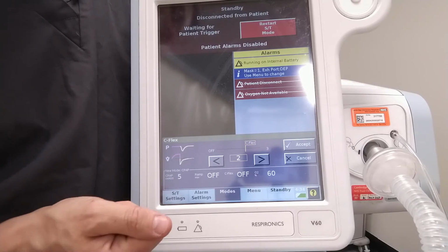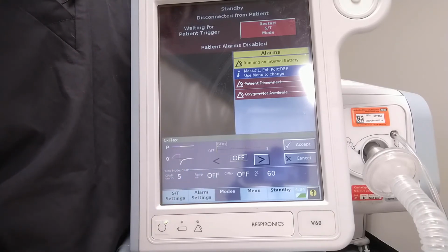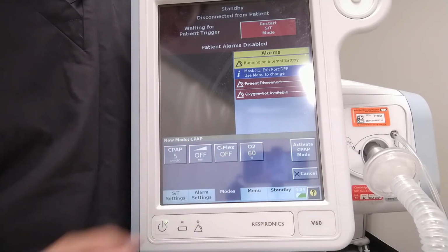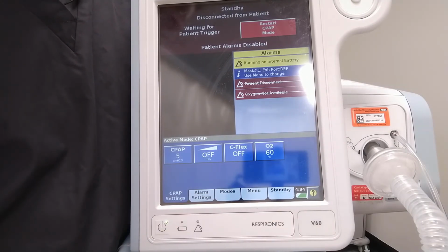What I'd recommend is, when you're starting off CPAP in the patient with acute respiratory failure, leave C-Flex off and accept it. And then go back into the settings later if you find the patient is finding it difficult and increase the level of C-Flex. If you max out the level of C-Flex and the patient is still finding it difficult, you may have to drop the level of CPAP altogether. Once you have the settings that you want, press Activate to start delivering CPAP.